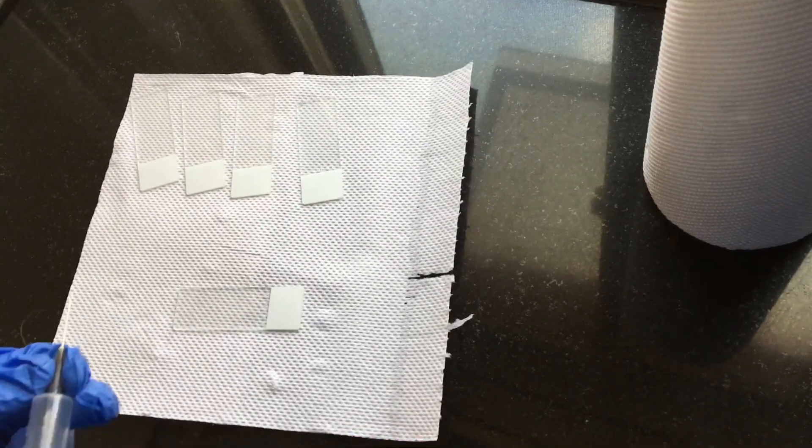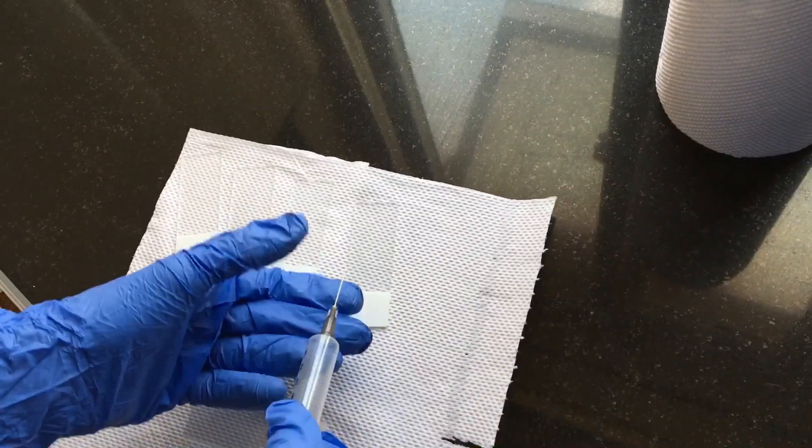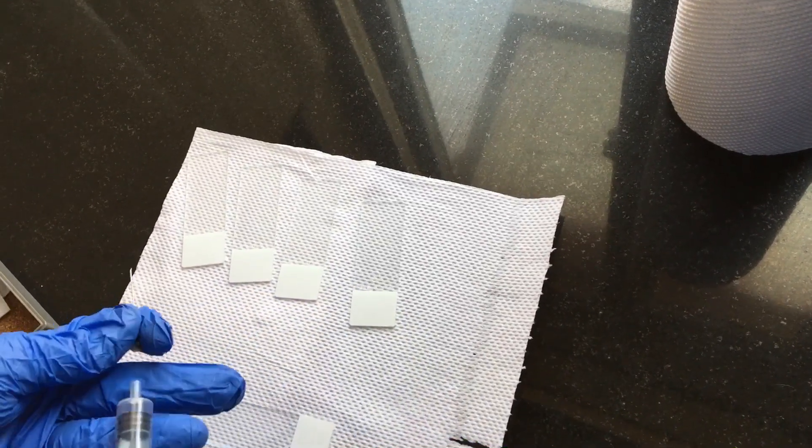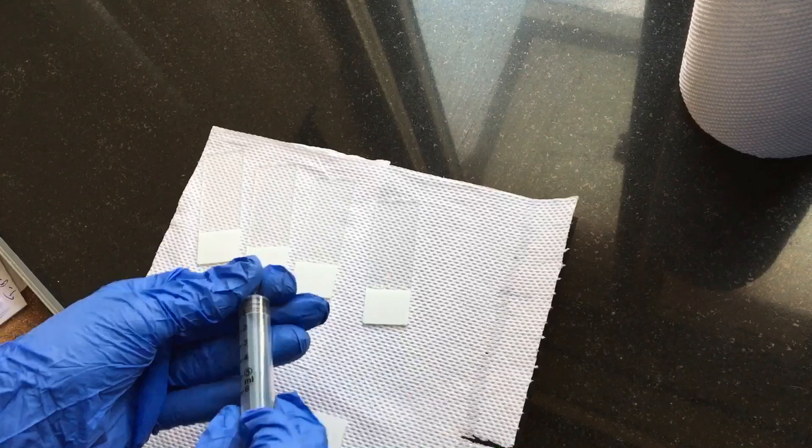After collecting the sample, I am going to make smears. Make sure you always suck the air into the syringe before you fix the needle.